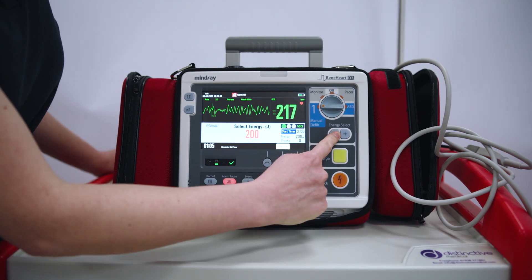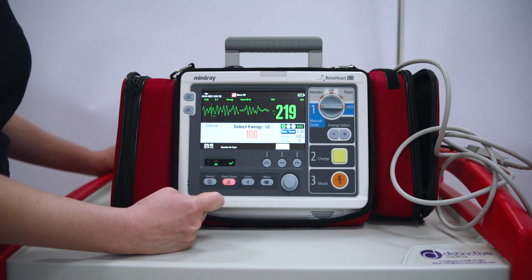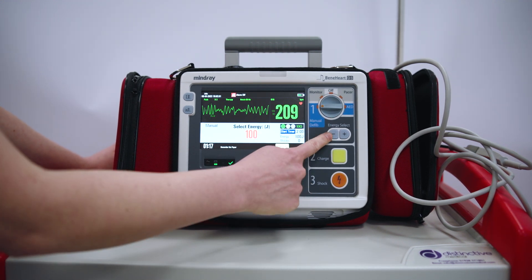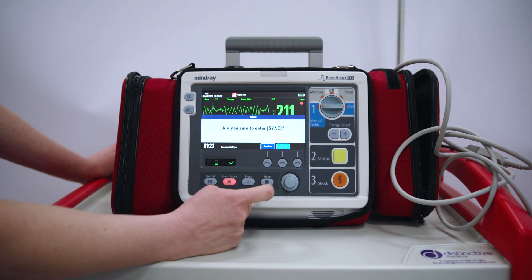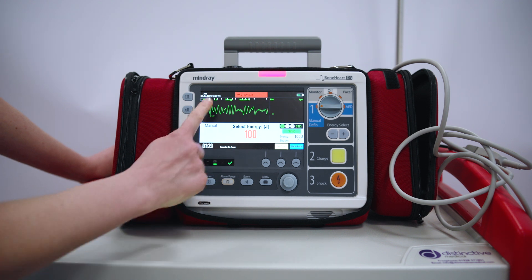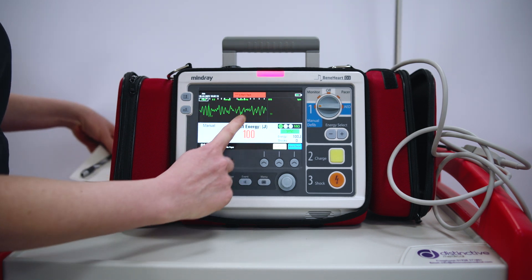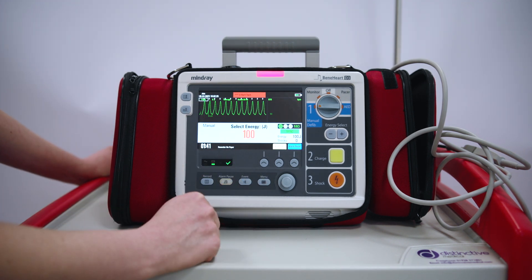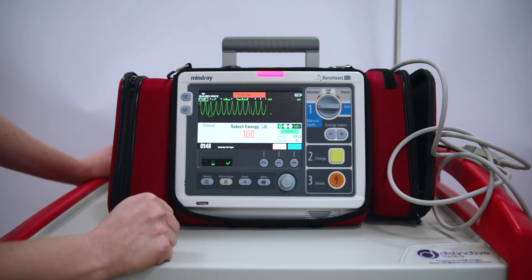If I wanted to cardiovert a patient, I need to put it into sync for any tachyarrhythmia that we need to treat by cardioversion. I put it into manual defib and dial down the energy to 100, then press enter sync. It asks: Are you sure you want to enter sync? I press confirm. I know the defib is in sync because I can see the white markers on the R wave, and it is flashing green for sync.